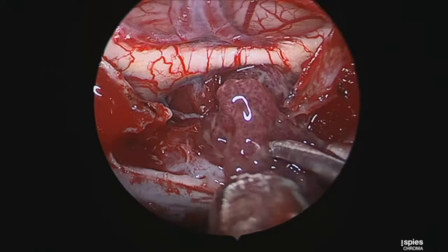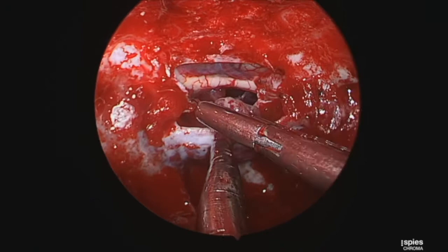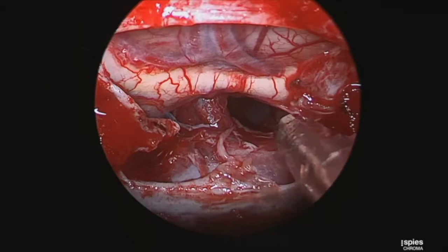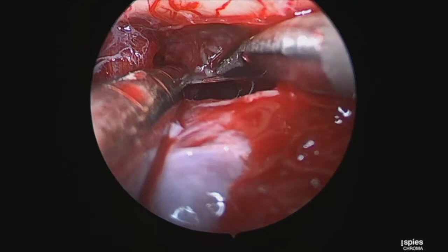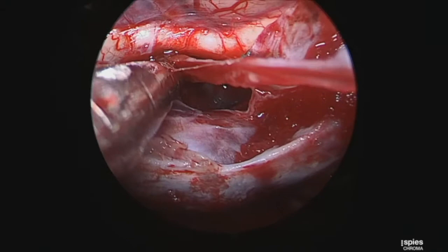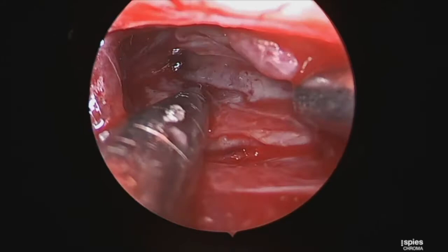We are able to work around the side of the stalk, preserving it, and carefully delivering the internal contents of the tumor. There is no aggressive pulling of the tumor — merely dissection and allowing the tumor to deliver itself. Here we can see the tumor capsule attachment, and bringing the endoscope into the suprasellar space around the stalk, we can see the posterior attachment, which appears to be on the posterior aspect of the stalk right at the tuber cinereum. Here we can see that attachment carefully peeled free, and then posterior inspection shows residual capsule.